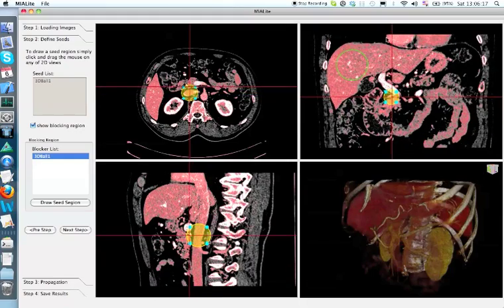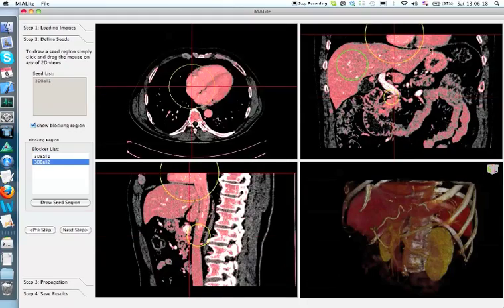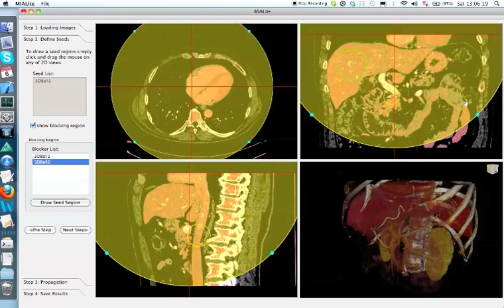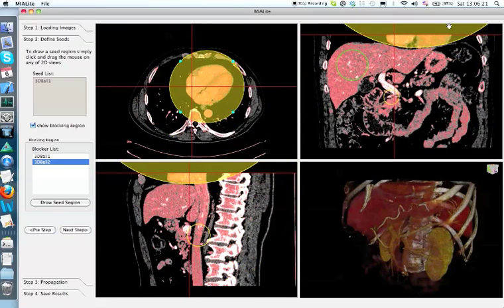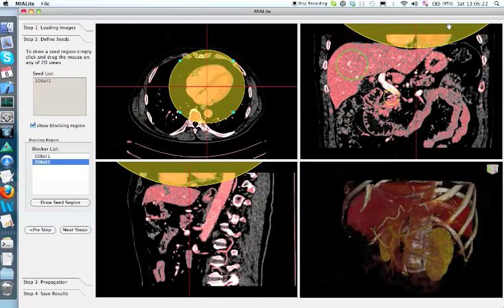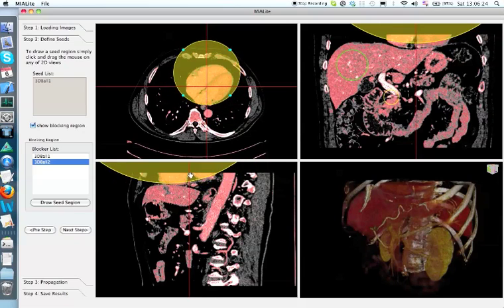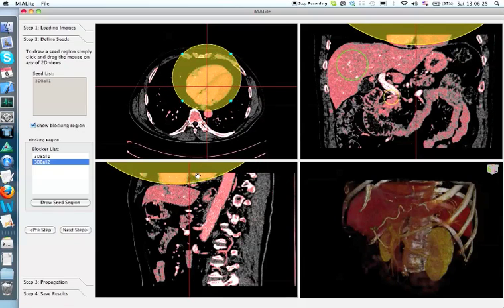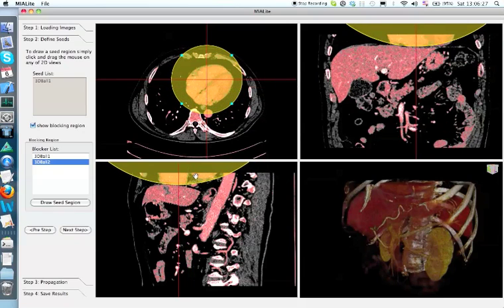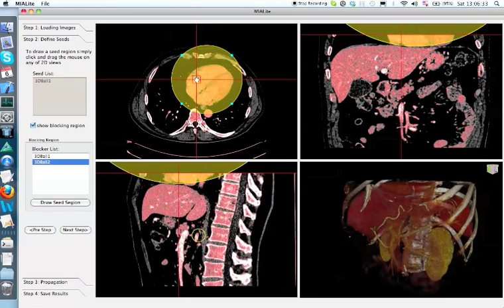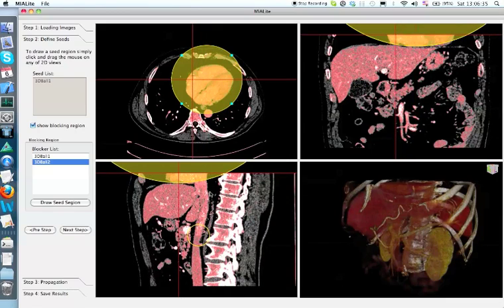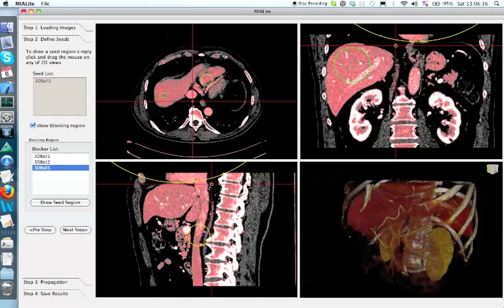And then the heart, the myocardial almost has the same density as the liver, and they are very close to each other, so here we manually put a blocker on top of the heart. And then the other end of the vena cava.